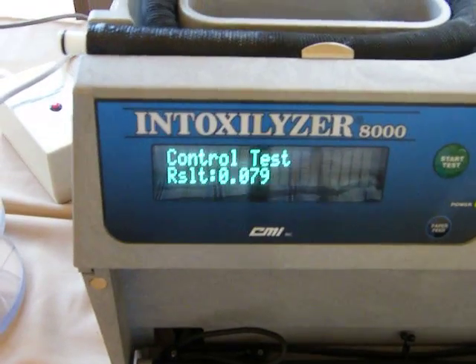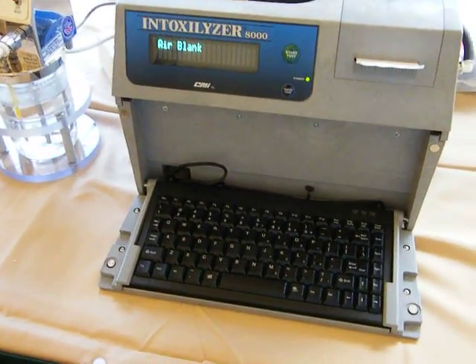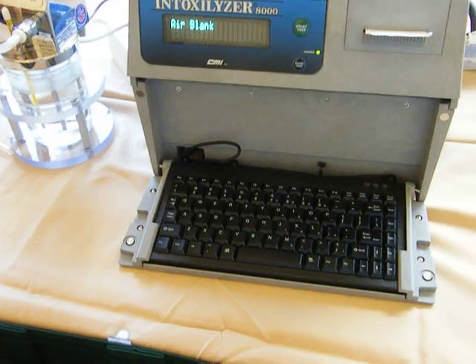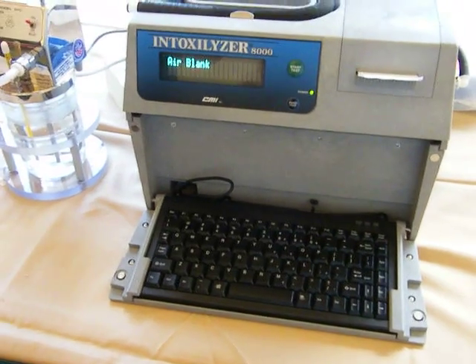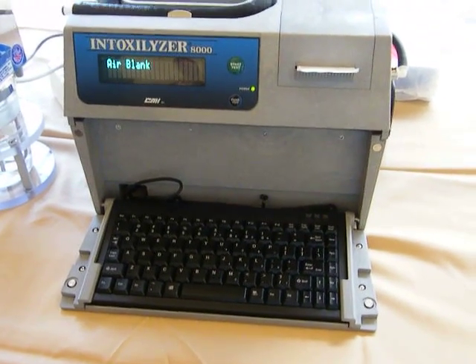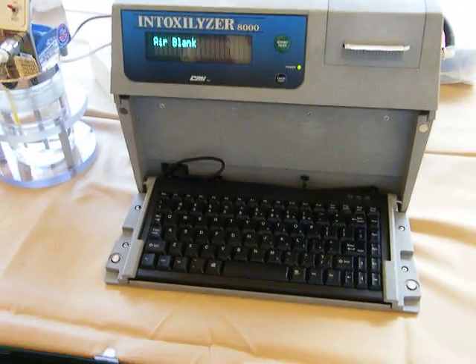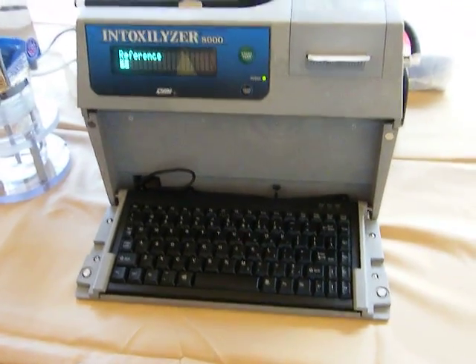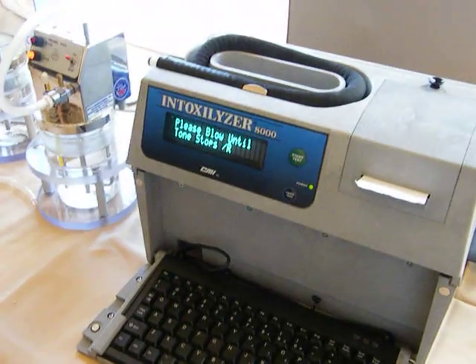It reaches .079. We're going to do a bread test here right now with Wonder Bread. Charles is eating the Wonder Bread and I'm videotaping it. It just finished the control test. So what we're going to try to get here right now is an invalid sample — though we already got one. He's going to try to get it to read. Are we going for a read or invalid sample? Valid sample. All right, we're going to try to get it to read a .009.